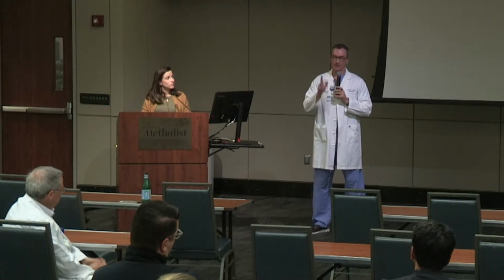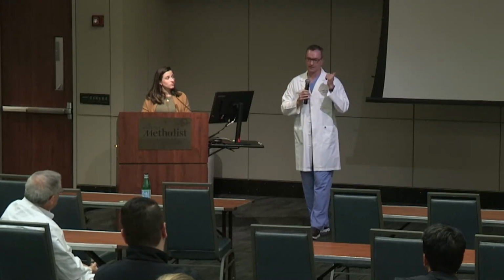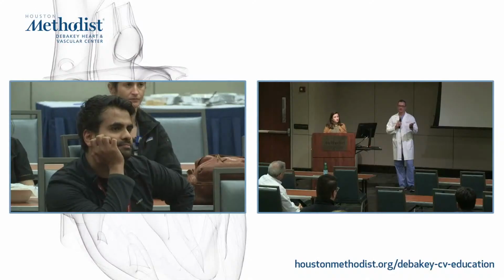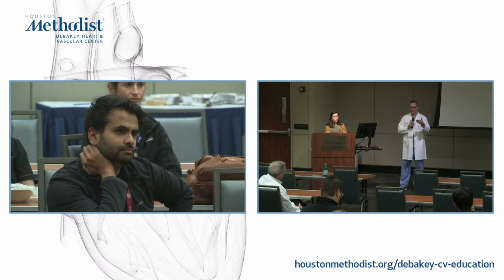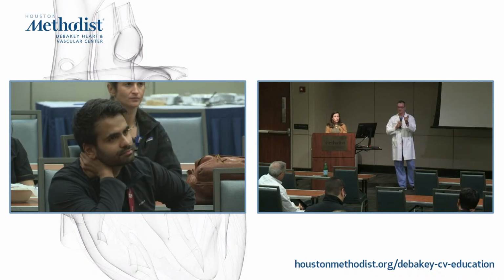I mean, the argument that always comes up is the RV pop-off. The TriClip was not perfect. You will leave some TR. And if you're doing it in a sick RV, is that a good thing? Do you want to have no pop-off on a sick RV? The TTVR is very good at TR reduction. You're going to go to 0 TR, but you also paralyze the annulus, because you have this annulus paralysis.